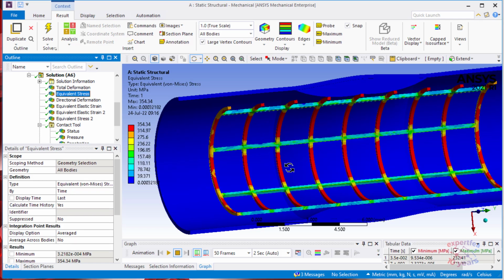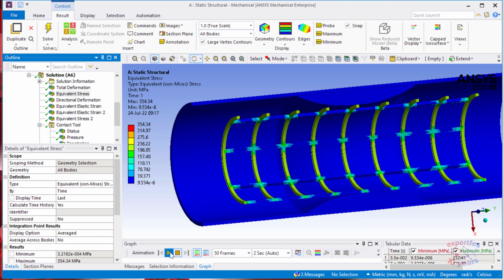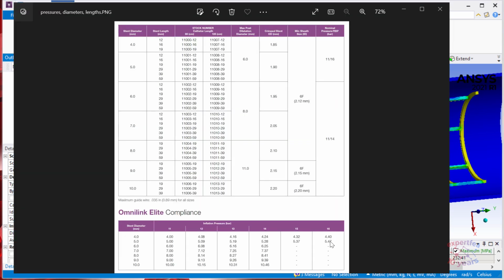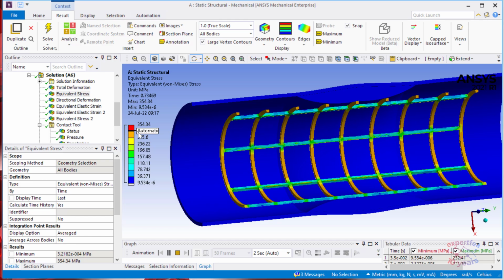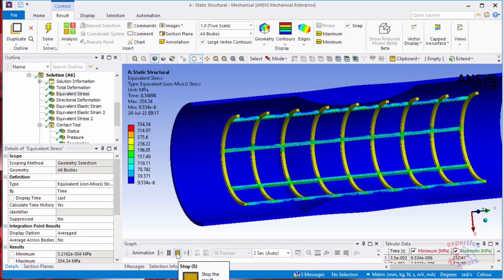Alright, let's look a little at the equivalent stress. You can see that the values are pretty high because we exceeded what was recommended. Remember that I made a judgment here with 0.25 and 0.5. It's kind of close to plasticity, but when using a superelastic material, plasticity should not occur.